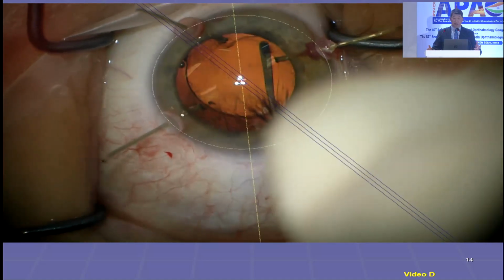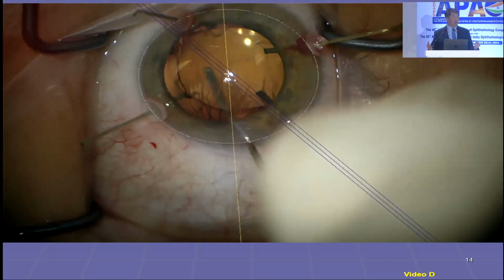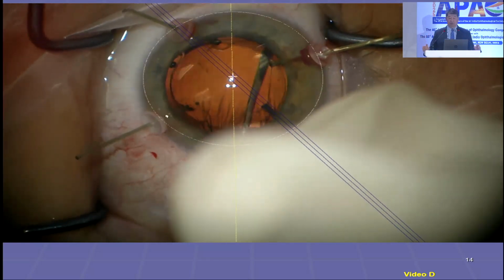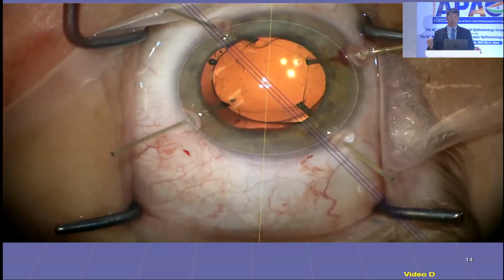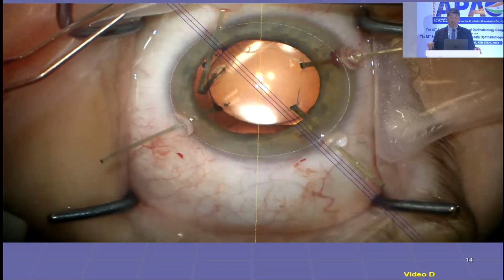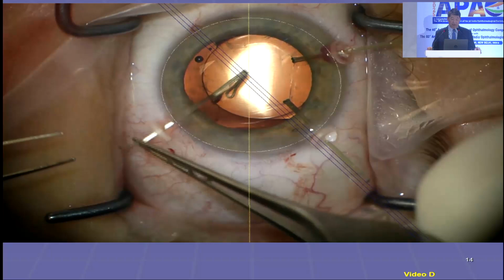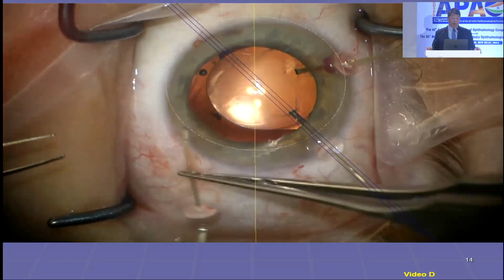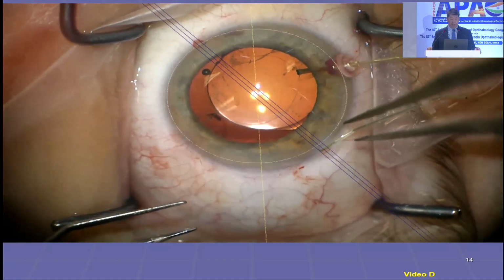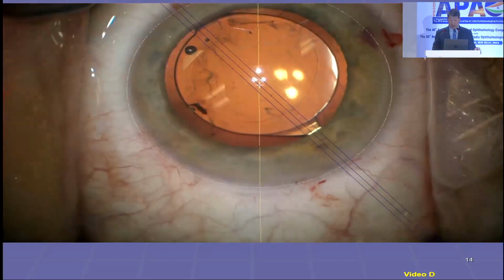And it's amazing, so this is a great demonstration for you now of capsule retractors. Look at the difference between with and without the capsule retractors, just the simple rotating of the lens. So they're supporting the bag like artificial zonules, they support the AP direction, and then we're going to take them out. Okay, we finally got the lens here, and I still haven't done the other cataract, which is why she was referred, but I'm feeling okay. There's no vitreous going around there. And anyway, so we take that out.